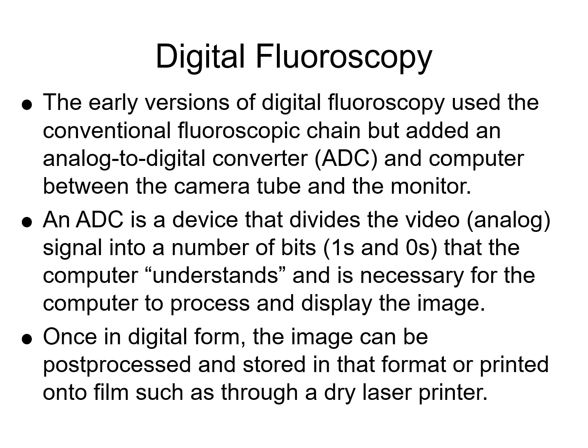The colors we assign to those picture elements can be represented by binary code, ones and zeros. And so we can display it visually on a monitor, but also we can manipulate it with a computer program. So the ADC is critical to digital imaging, taking what is a visual piece of information and turning it into an electronic piece of information, or a string of data to be interpreted by a computer. And so the ADC is revolutionary, as well as the CCD being revolutionary. Both of these components, but an ADC can take any visible light source or any analog source and change it into a stream of ones and zeros, a stream of electrons, essentially.